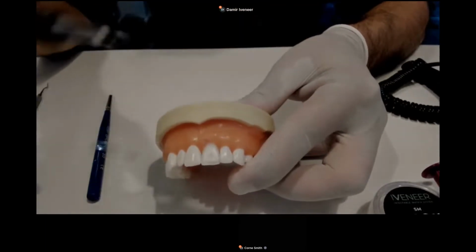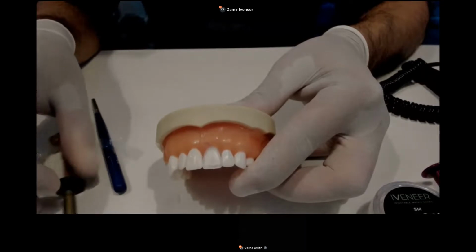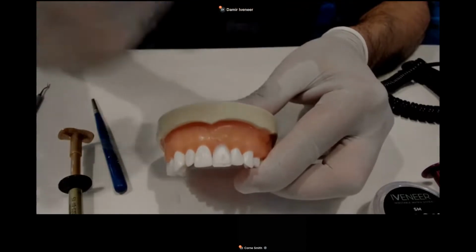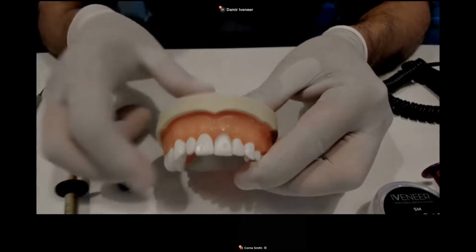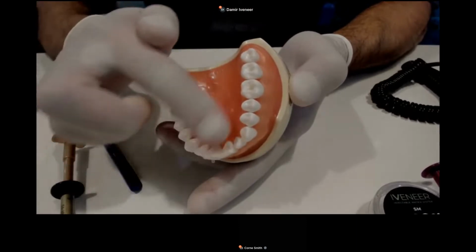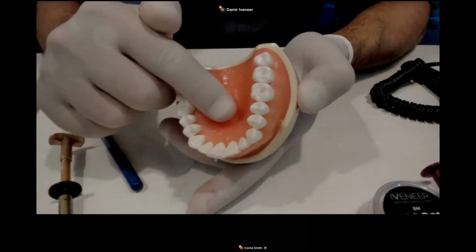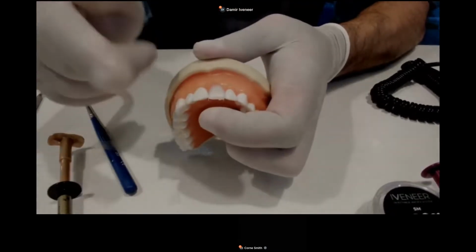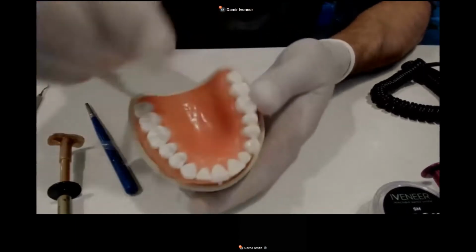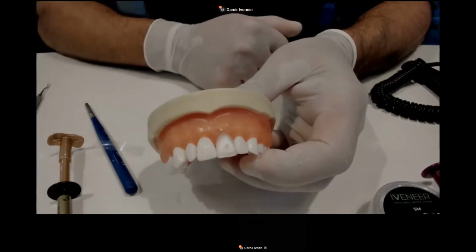So when I push the material now inside and inject it, it will fill the area very fast. If I push the composite and I feel that I still can push, it means that something is open, and when you look from behind, you will see an excess. If you see an excess, you have to clean it with a silicone brush. Don't cure it. Clean with a silicone brush, and don't cure yet, then put your finger, push the composite again, and then cure. Because if you cure after the excess, it will be cured from the inside and you cannot push the material again.